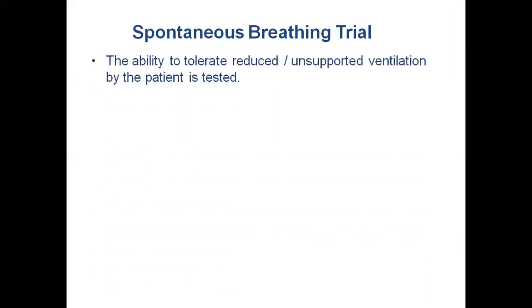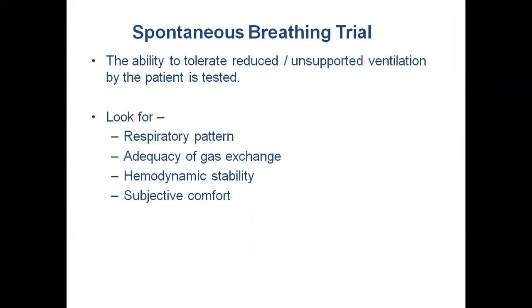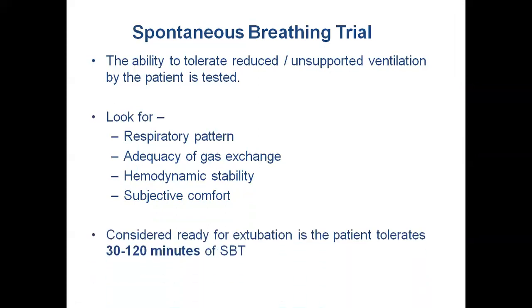We can put the child on pressure support, sir, or we can use T-piece to see if the child is able to maintain by himself. Yeah. So a spontaneous breathing trial is where you reduce the support or remove the support from the child, and you look for respiratory pattern, gas exchange, hemodynamic stability, and comfort levels. You need to give at least maybe 30 minutes, and up to 2 hours, you can do the SBT. When you have to make sure the child will tolerate or not, you can prolong it to 2 hours. But if you pass after 30 minutes, you can easily extubate a child.